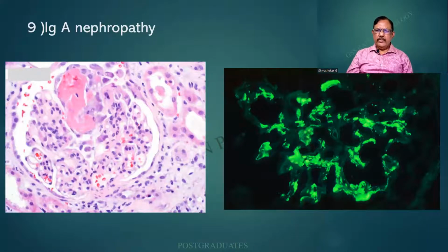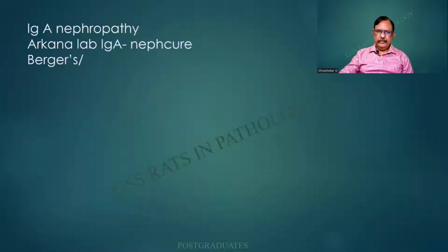The next group of diseases will be the IgA nephropathy. IgA nephropathy is a university question for you people, in which one of importance will be the proliferation or the thickening of the mesangium over here. All the cellular elements are also getting proliferated, but then there is increased amount of congestion, and sometimes there can be a rupture and a leakage of cells into the Bowman space. I find that there is a leakage of the RBCs that are seen over here. And here also there is a granular deposit found in the mesangium throughout. So this can be a reference.